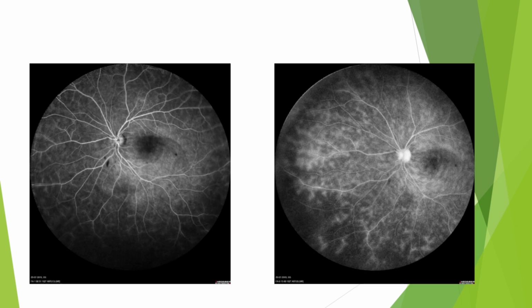So this is the FFA image. The first one is an early arteriovenous image showing multiple innumerable leaks, which increase in intensity and size, causing a fern-like appearance in the late phase of the FFA.